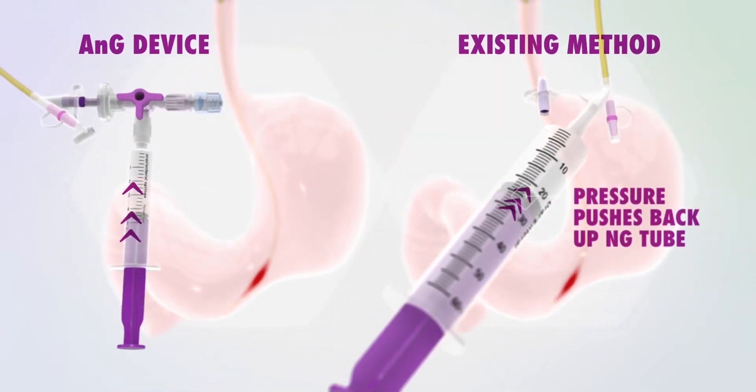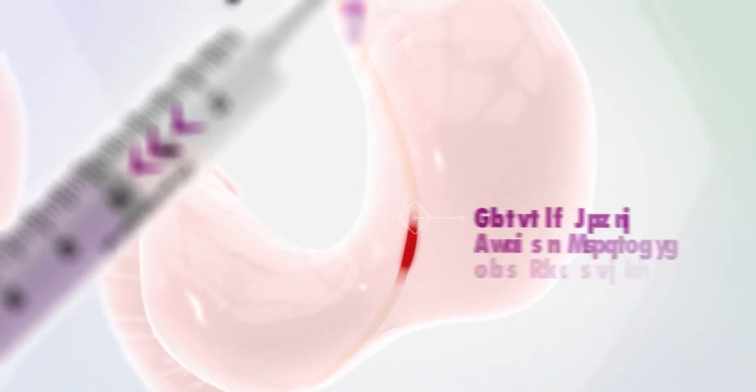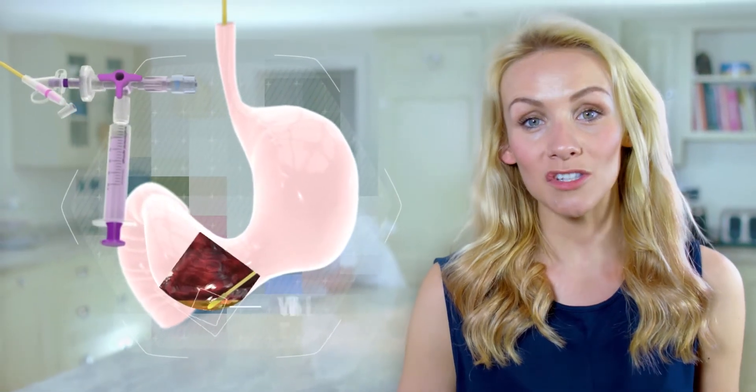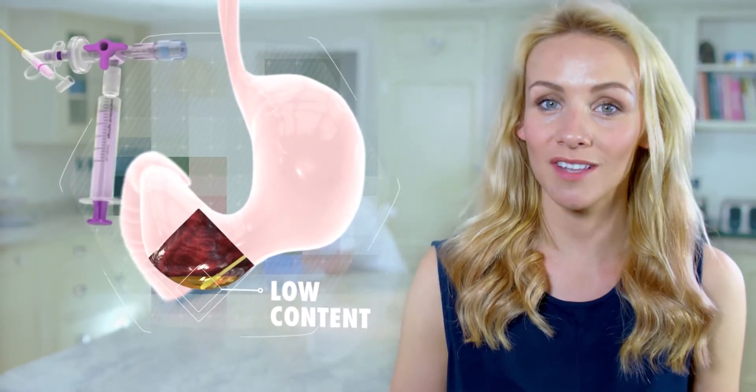This comparison clearly shows the key benefit when using the ANG device. It will work for patients with a low stomach content, making the procedure quick with no fuss and no mess.